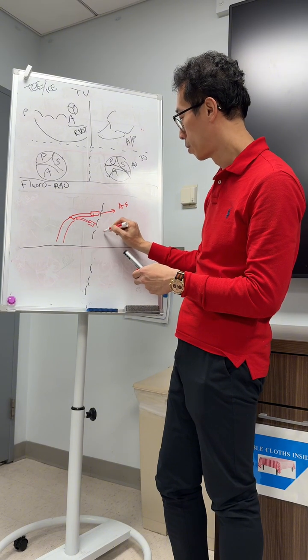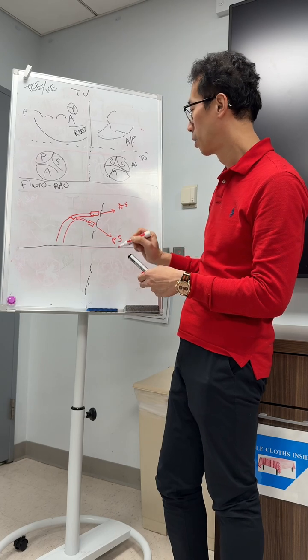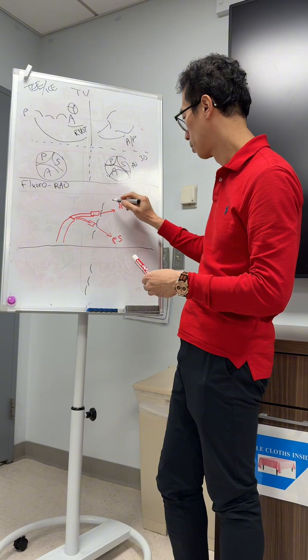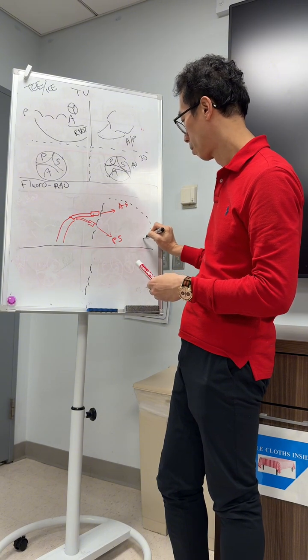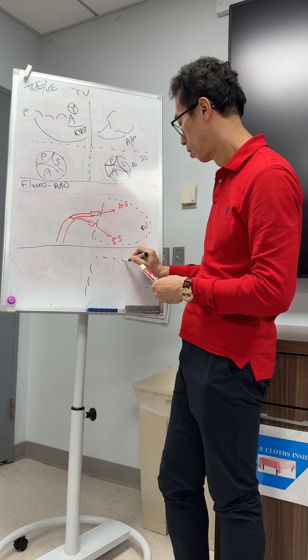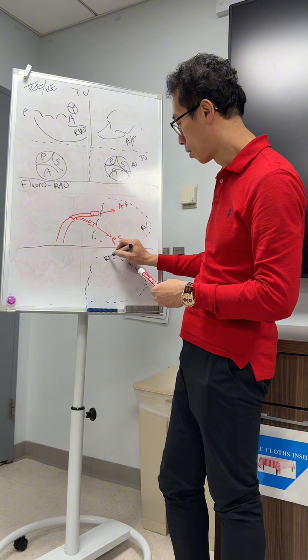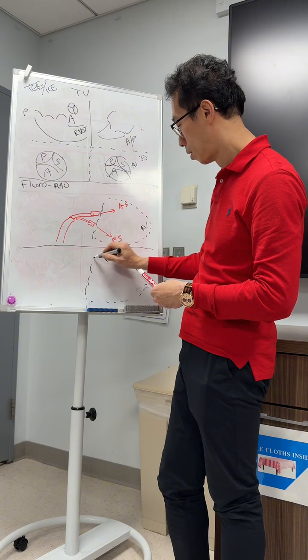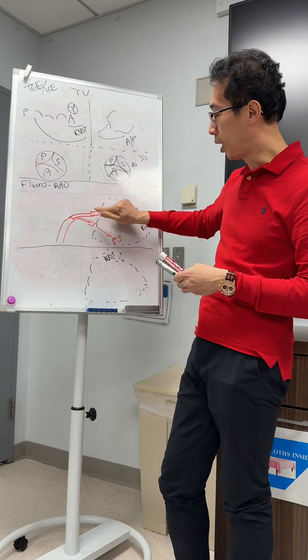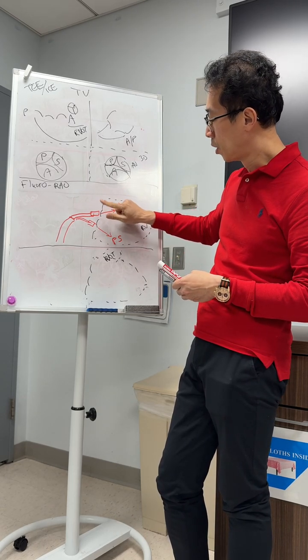This direction would be P, S. Okay, so let me just do that here. And remember, RVOT is up here. Okay? So AP is going to be more like, the arms will be like this. We talked about this in another lecture.